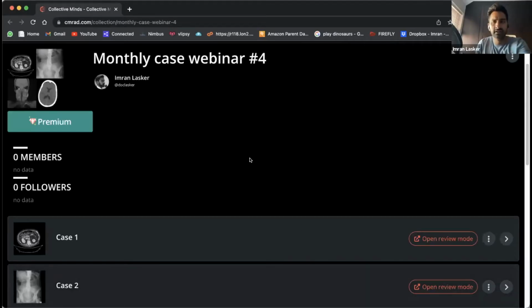I'm just going to share my screen quickly so that we can hopefully look at a few cases. So some of you may have come to previous talks and we've been going through a few plain films and kind of just getting to grips with plain films. If you haven't seen those, it may be worth going back and watching some of them because we went through a few plain films and then we started introducing a bit of CT. And today is going to be a little bit more CT heavy, I think. But we'll have a few plain films to help us go along.